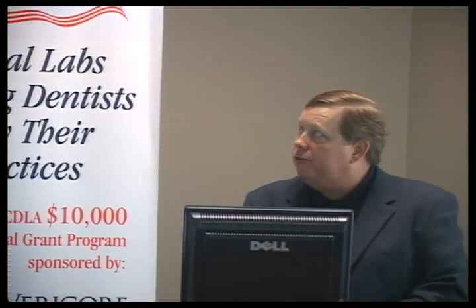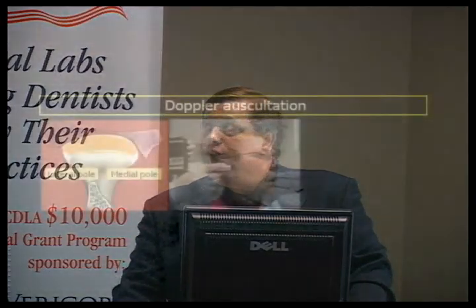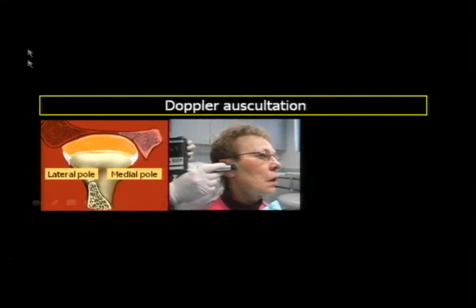I've used load testing for years, and it's a good tool, but it's not definitive. The next thing you hear is Doppler auscultation. Doppler is used when you want to try and differentiate lateral pole versus medial pole problems. And as a result of that, it's a great diagnostic tool.